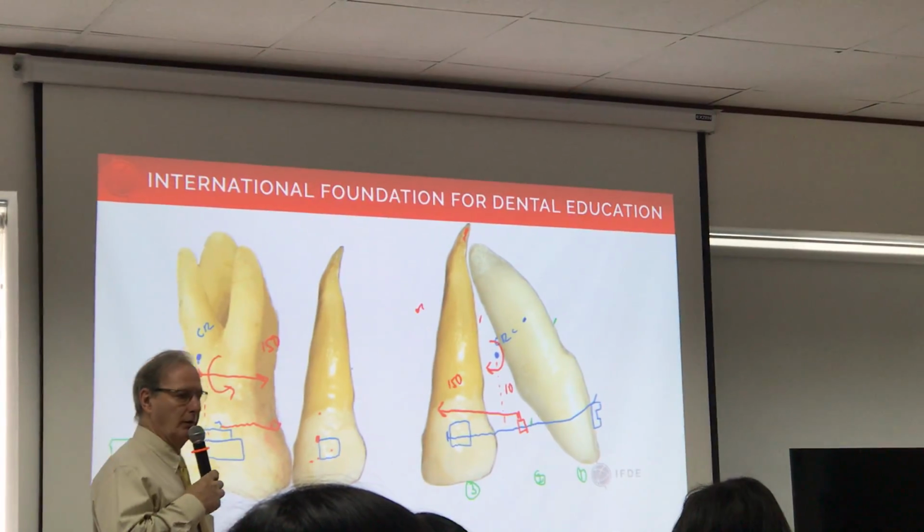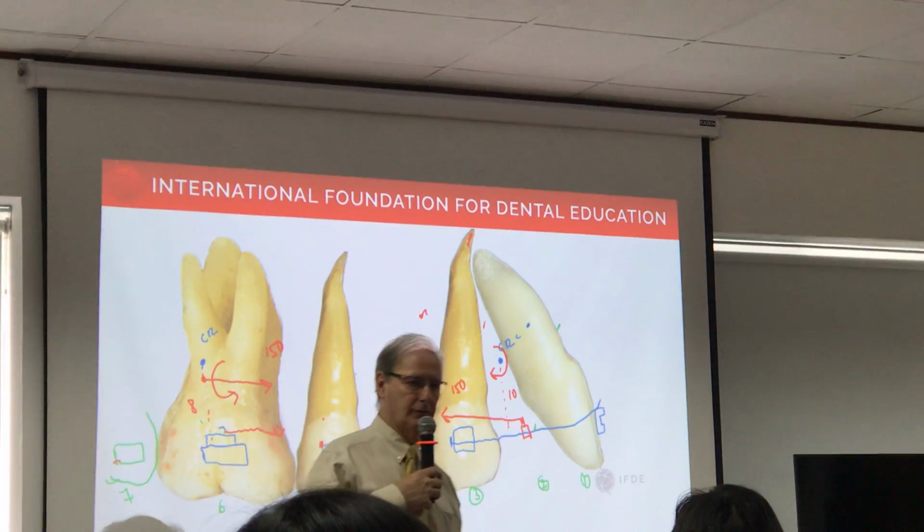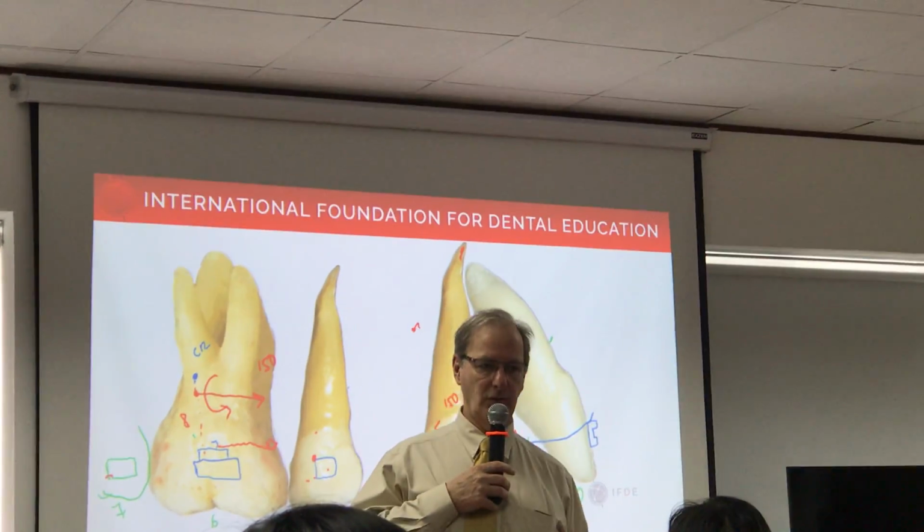So when you put your wire in the patient's mouth, and you notice how it slides in the bracket, or it's tough to put in.